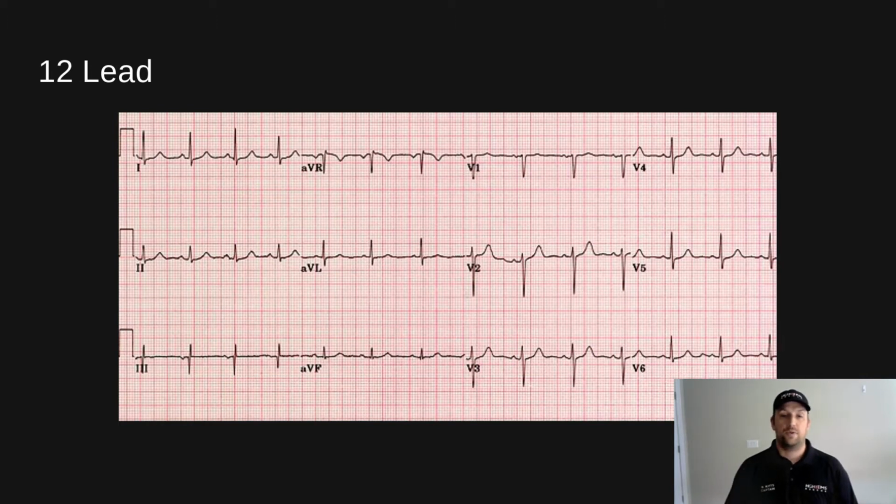I often see people get stuck in the habit of evaluating ST elevation immediately after obtaining a 12 lead. Doing this can easily put you in a position in which you frequently mislabel 12 leads. 12 lead interpretation is about having a systematic approach. I'm going to provide you with the 12 lead approach that gives you specific steps to follow to help you increase your success with 12 lead interpretation.